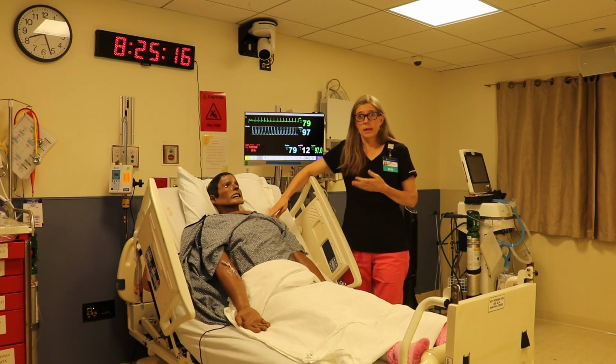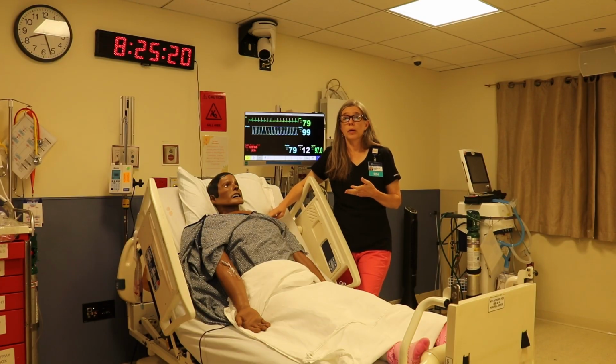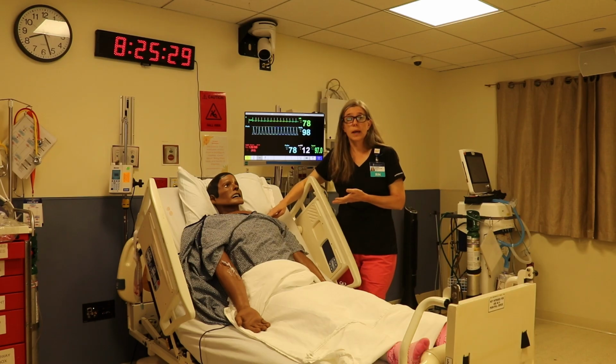The functions of the mannequin in your simulation will be determined by your learning objectives and the progress of your simulation scenario. It will be important for you to engage with the mannequin just as you would a patient. So talk to the patient to gather more information and complete your assessment. Use chest rise and fall and lung sounds to determine respiratory status.